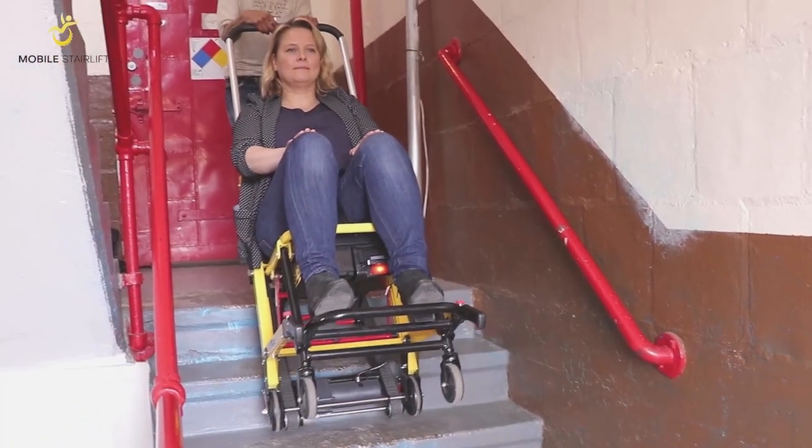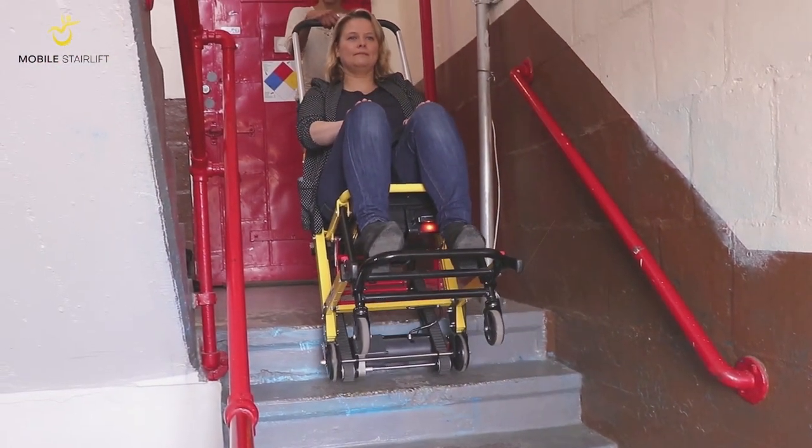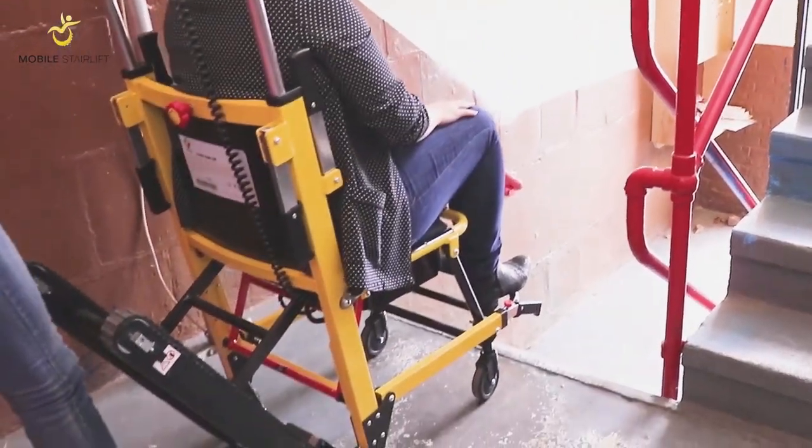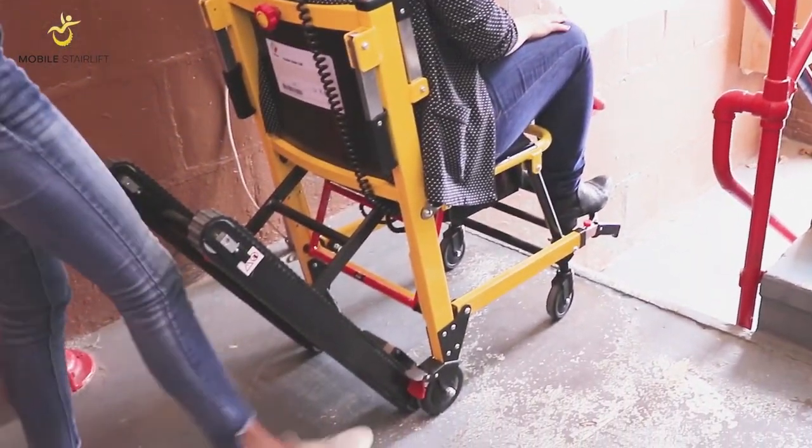When you reach the top of the stairs, take care to push the handlebars forward and balance it on the locked back wheels so that you are not holding the Stair Lift's full weight with the handlebar.